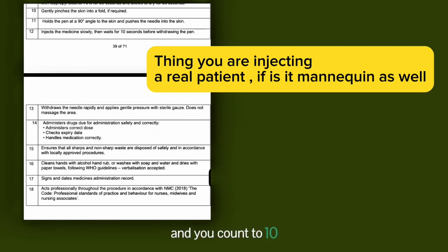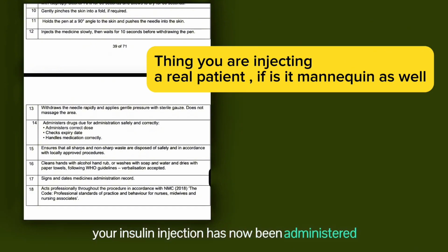Count to 10 to allow the insulin to enter the body. Like 1, 2, 3, 4, 5, 6, 7, 8, 9, 10. Then remove the needle from the skin. Patricia, your insulin injection has now been administered.